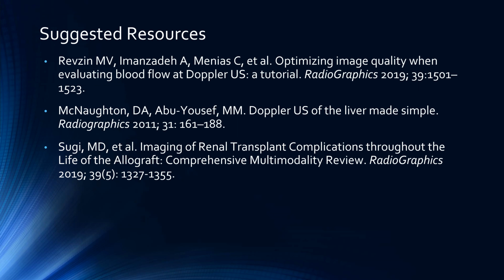I think at the moment, I would say that we should just continue to limit it to documenting portal vein patency, like doing what we would do routinely for these. So a color Doppler examination, but not necessarily a full spectral portal vein examination. But that may change. What I am planning to do is put together a separate document.